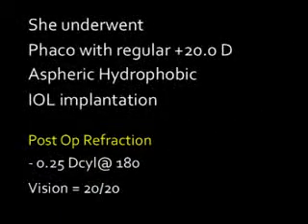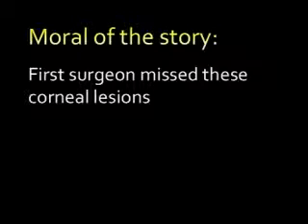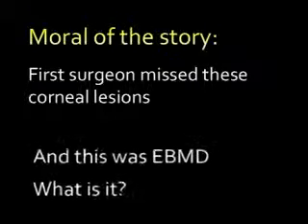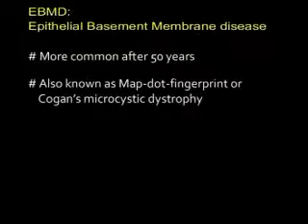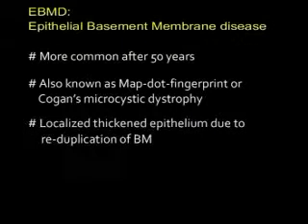She underwent phaco with regular aspheric hydrophobic IOL implantation. Moral of the story: the first surgeon missed the corneal lesion, and this was EBMD. What is EBMD? Epithelial basement membrane disease, or EBMD, is also known as map dot fingerprint or Cogan's microcystic dystrophy. Localized thickening of epithelium due to reduplication of basement membrane.